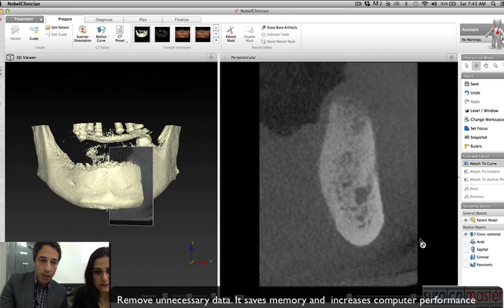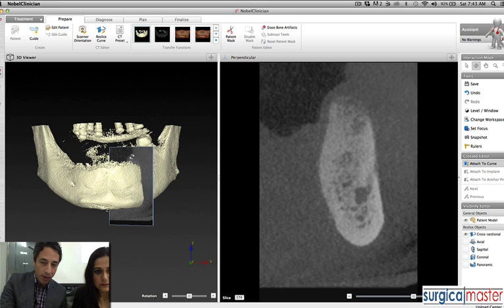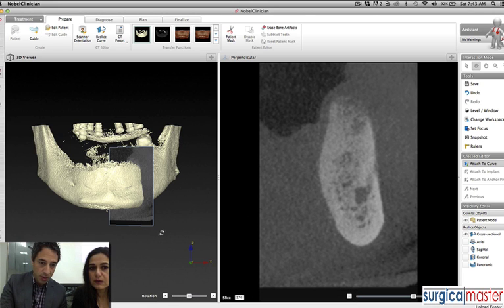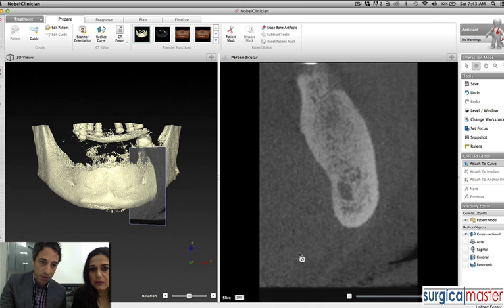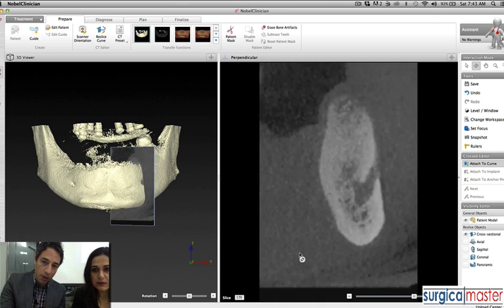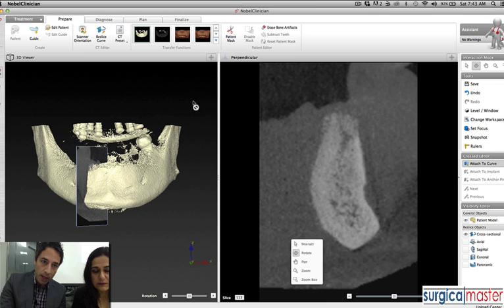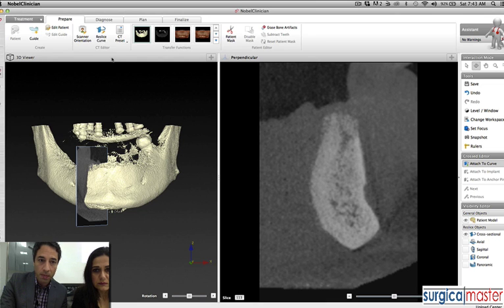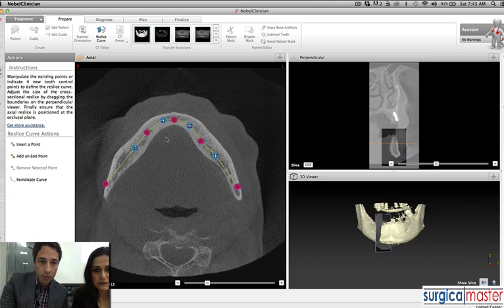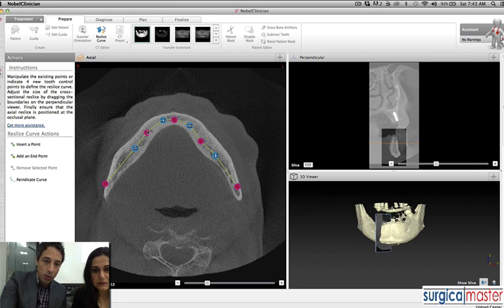On the left-hand side you see the 3D rendering. On the right-hand side you see the individual cross-sections. As I move the cross-sections, you see it moving along the arch. I can possibly define the arch a little bit better. This is how we define the arch, so the cross-sections will move along this line right in here. That's pretty good.